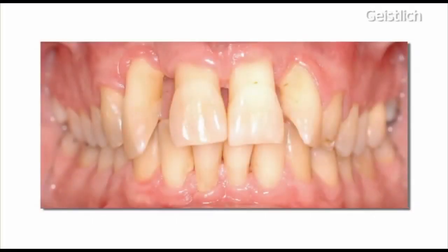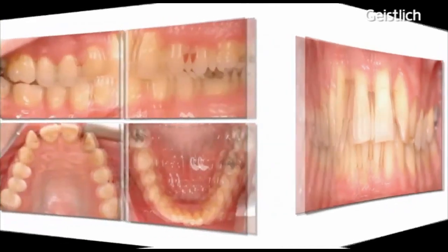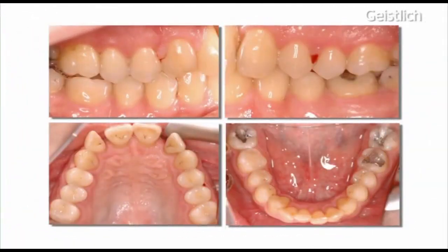This patient is in good general health, but suffering from severe periodontitis. He received prophylaxis, including instructions in oral hygiene, scaling, and professional tooth cleaning. In order to continue with periodontal therapy, areas with mucogingival problems need to be corrected.